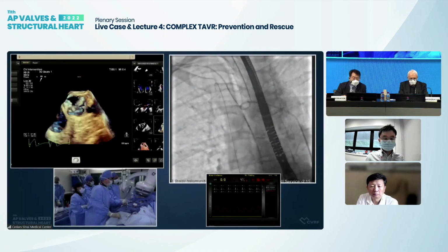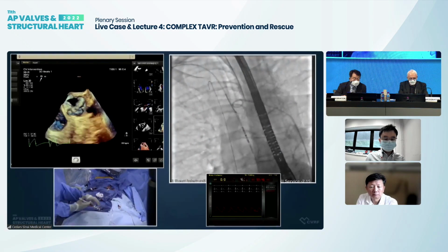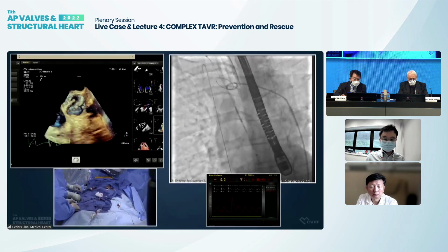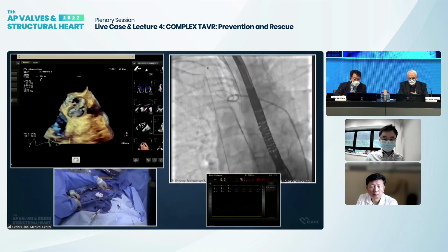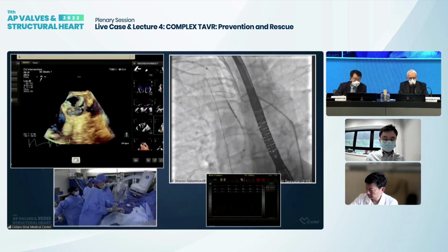So Raj, thank you very much. It was brilliant, and thank you for the case presentation. There's one good thing about it, that the patient has good left ventricular function, everything else is tough. And we had cases yesterday, Raj, and we just kept going while we were discussing and asking questions. Maybe you can ask a few.